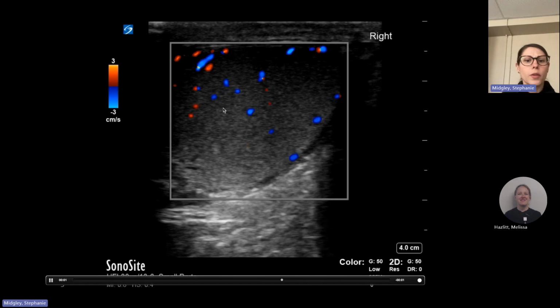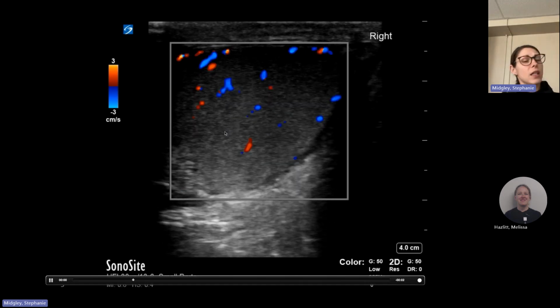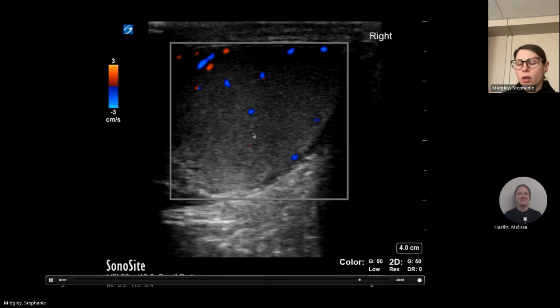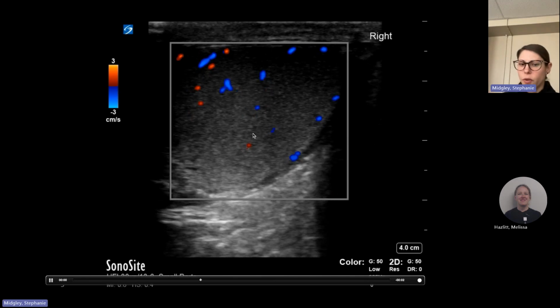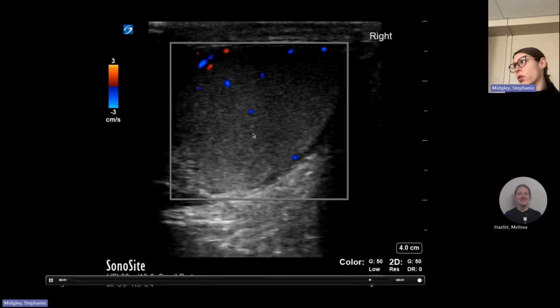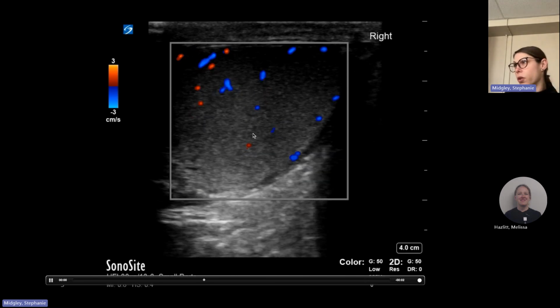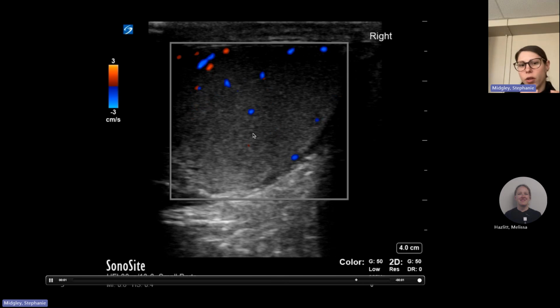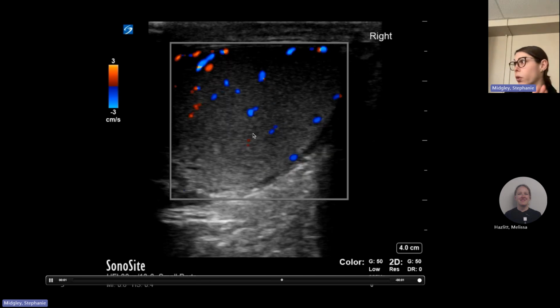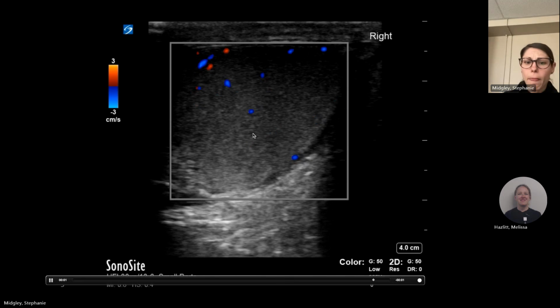And so you want to make sure that you're adjusting the settings so that you can detect the slowest flow possible. So you always want to make sure that you start on the side that doesn't hurt them. And you're going to do all your gain settings, the color gain settings, on the unaffected side so that you have what their normal looks like.